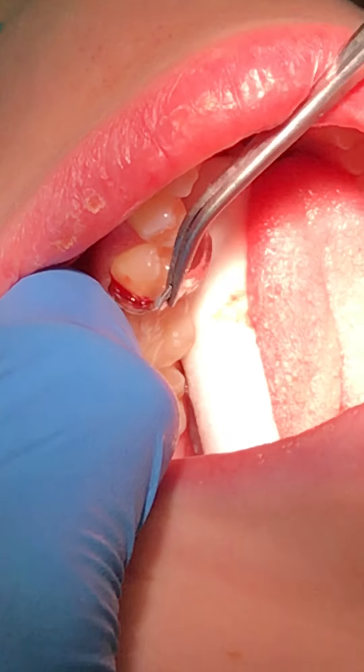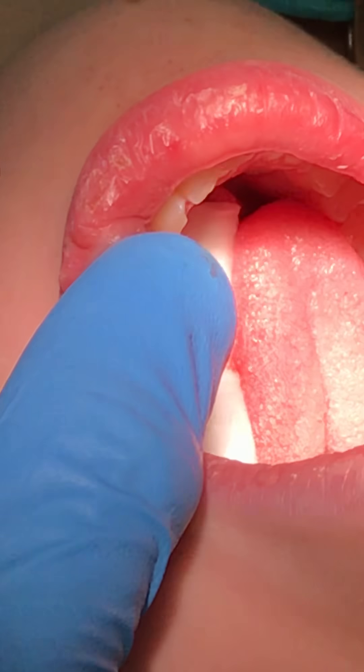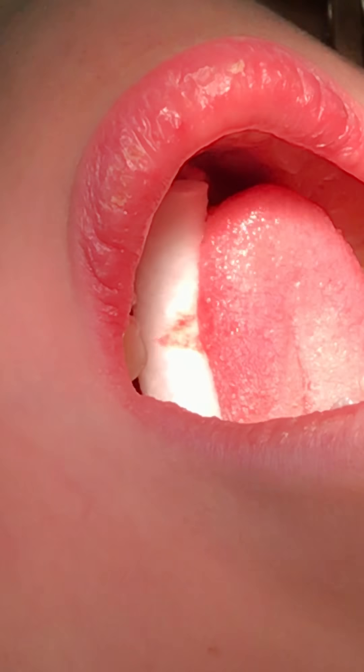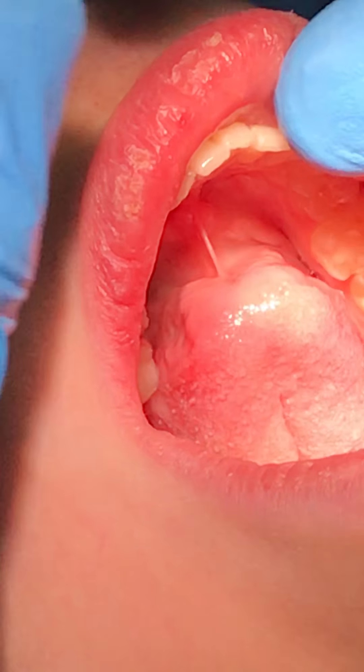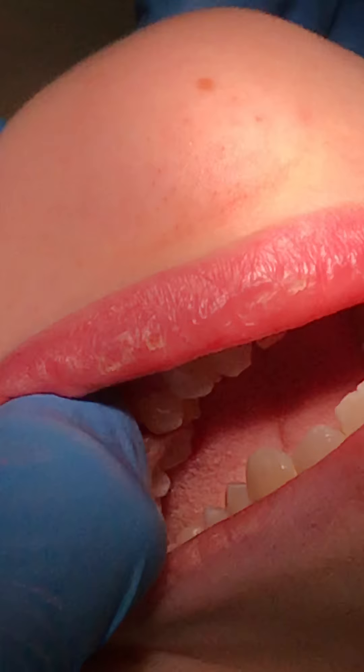There's a little redness, a little bit of bleeding because it was next to the gingiva — that's not a big deal. What we're going to do is trim it back. Just relax your jaw for a moment, just close for a moment.